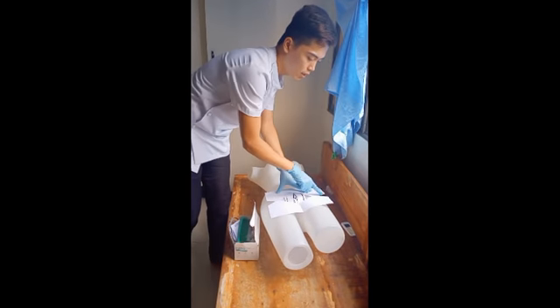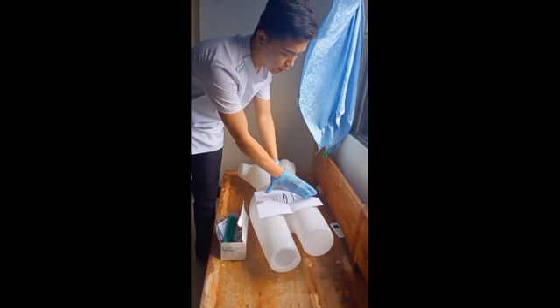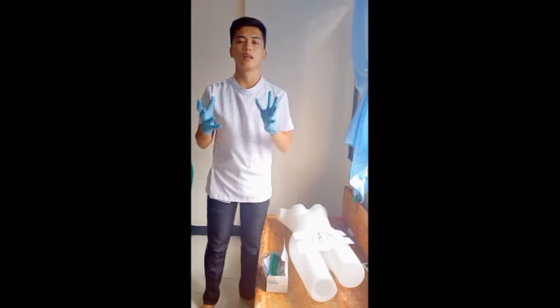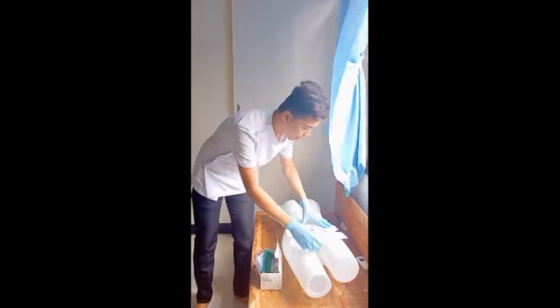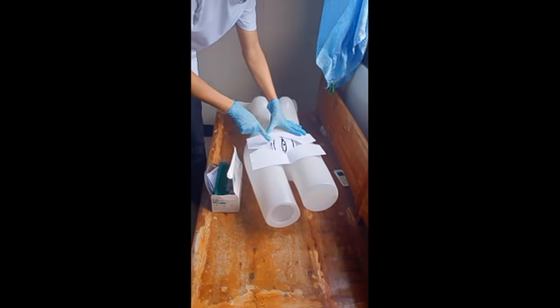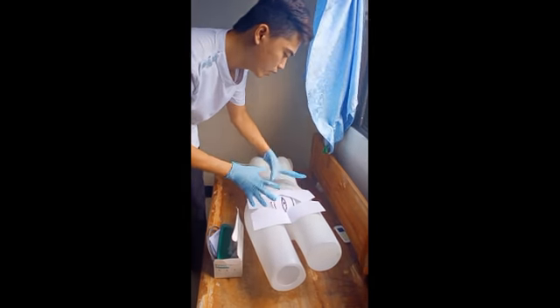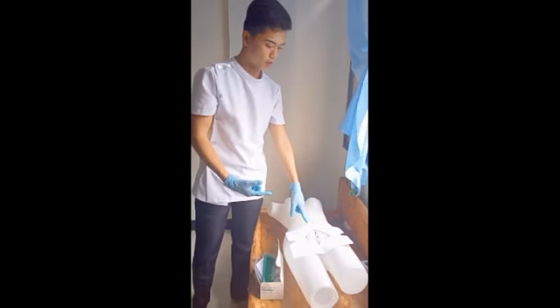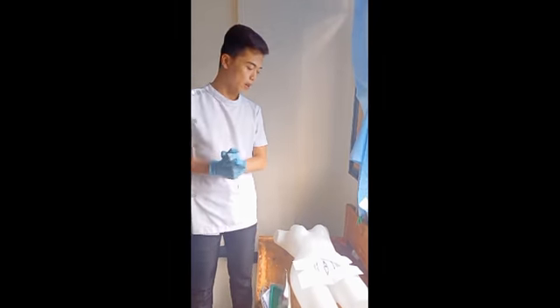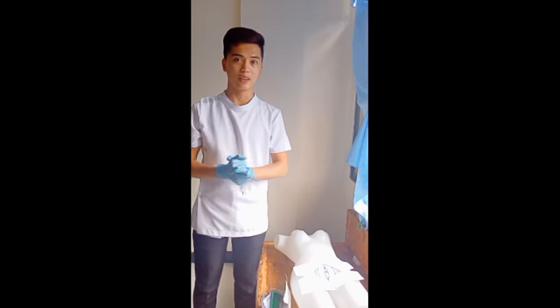On the other hand, this one is used to easily widen the legs of the patient. And if you can see, this is a rectangular shape, like an open space, used to easily do the procedure, and it protects the entire procedure at the urethra.